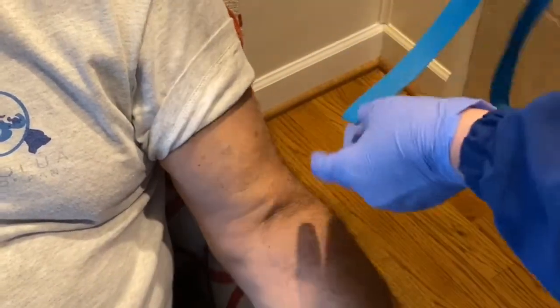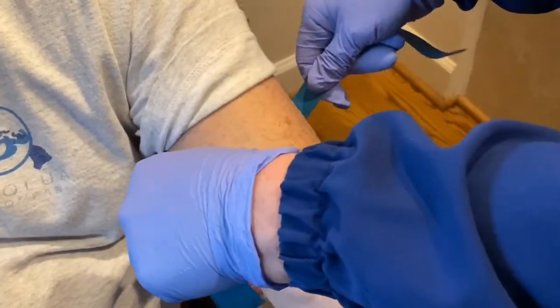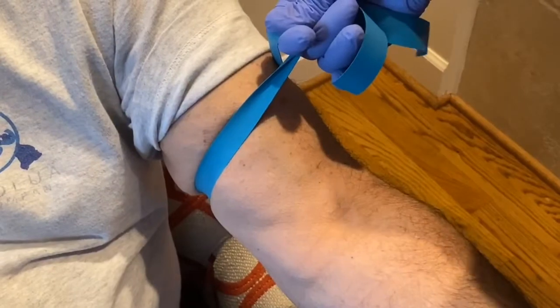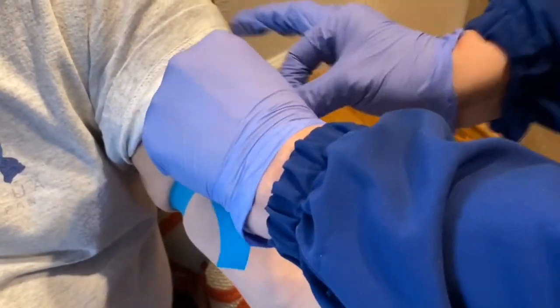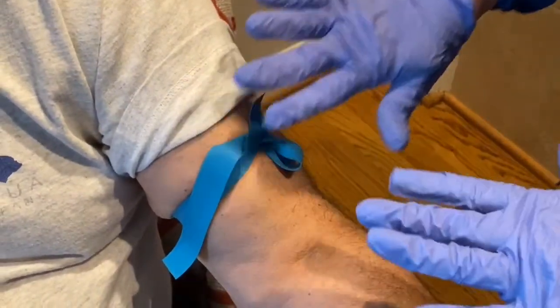What I want to do is keep the tourniquet flat, go above the arm — you want to be four to six inches above your insertion site. I'm going to pull it taut, come in with both hands, and holding with my dominant hand, I'm going to cross my tourniquet. I want to take and tuck under, making a U, and then let go. It has now created this tourniquet.